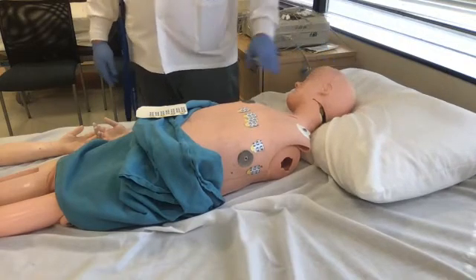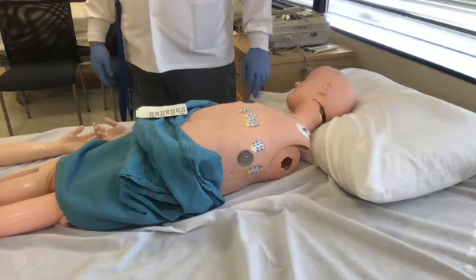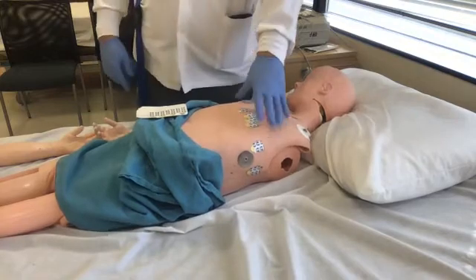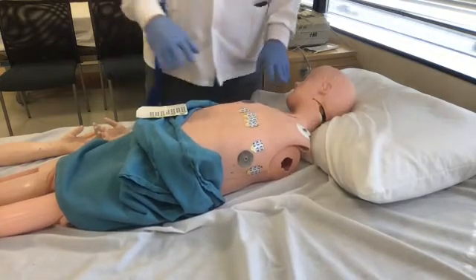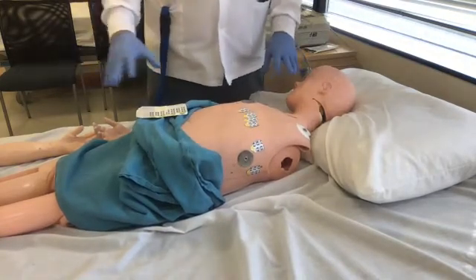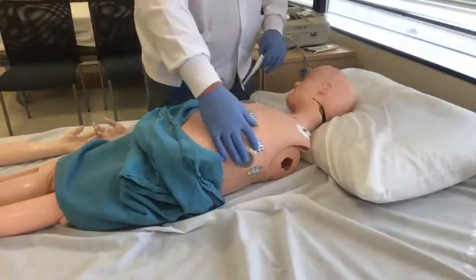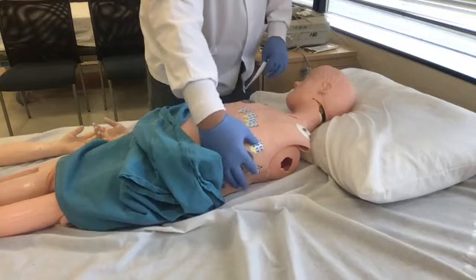Literally, the ones on the side are lower. Okay, this is the most correct way, but that brings me to variation, especially with the limb leads. There are other schools of thought where they take some of these.